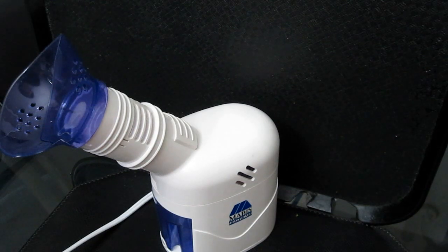Dry steam has very, very little moisture content. In fact, it's less than 0.5%, as opposed to the boiling water steam, which has a lot more moisture content to it. Why does that matter? Well, as far as your sinuses are concerned, that extra moisture that you're putting out there, that's what actually helps to loosen what's up there and get things going and kind of move things around. And so I think that's why the steam with the boiling water tends to work better over the bowl.